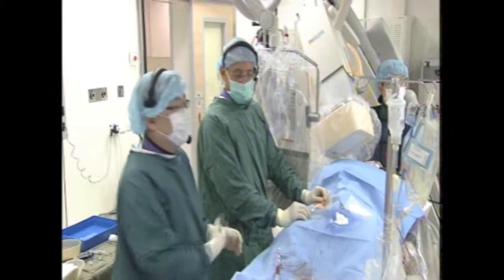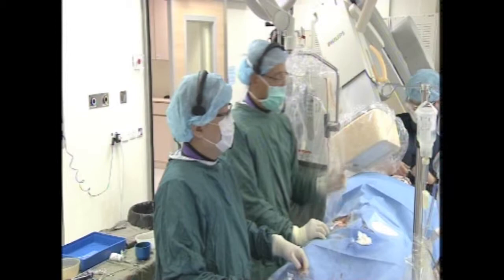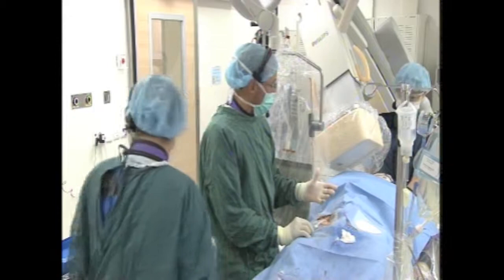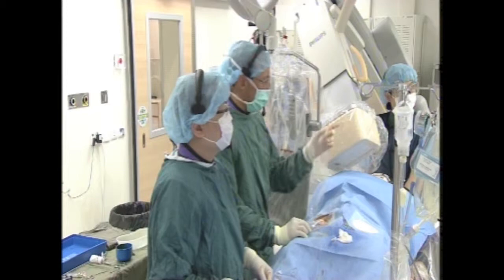I'm going to do the case with Dr. Rita Ibrahim. We have already done the transeptal puncture. We're working under deep sedation with propofol infusion — not general anesthesia. We got access from the right femoral vein, and I performed a pre-close of the vein at the beginning of the procedure.